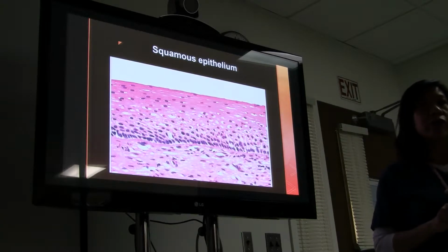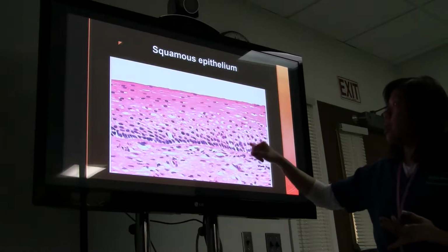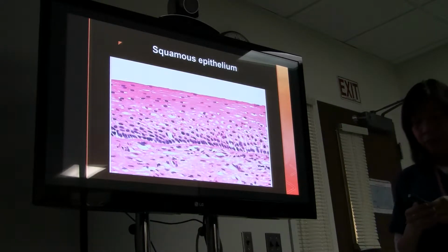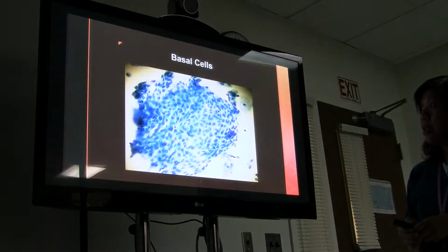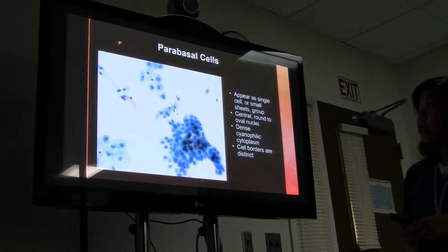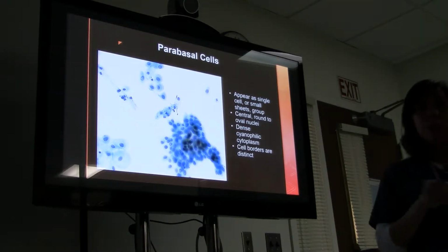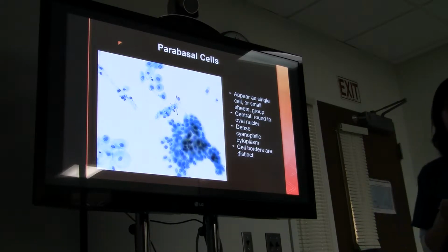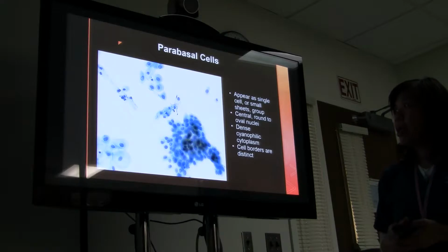There's no differentiation between much of the cytoplasm and the nucleus. Everything is kind of pinkish. But in Pap stain, you can see there are blue, there are pink, there are orange, and there are green. So you see more of the color, versus the monochromatic.